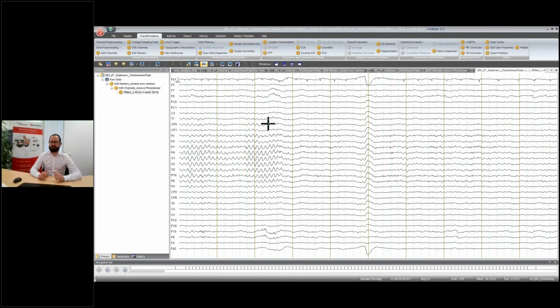However, I could also make use of the eye tracker because, as we know from the demo, our subject looked away from time to time and did not pay attention to the center of the stimulus, to the area of interest. This means there might be trials where we don't have a very nice visually evoked potential, and they might contribute a lot to the average, so our ERP might get much smaller.